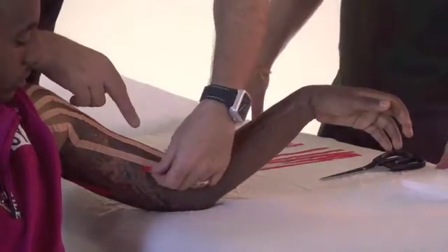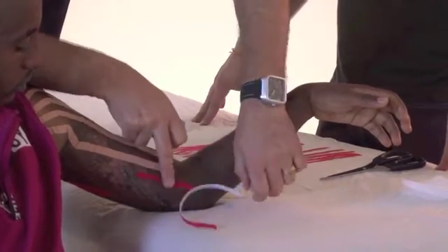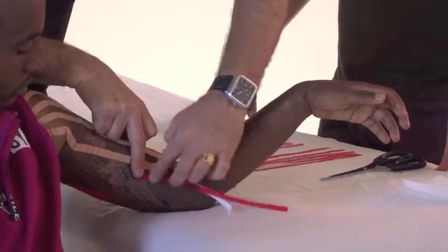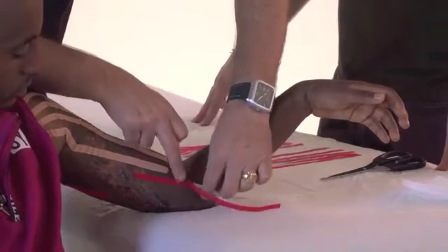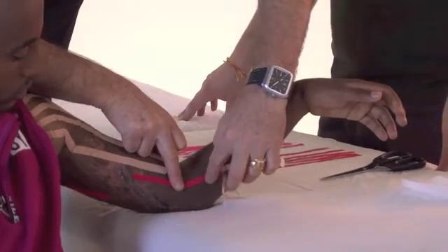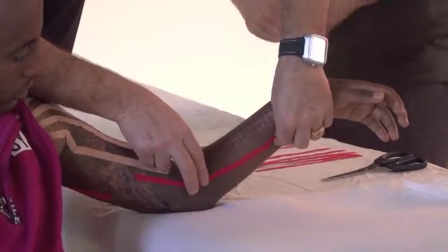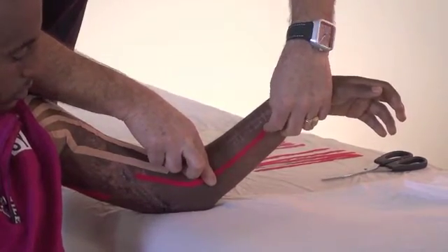We are going to apply the tape, just like that. Take off only five to ten centimeters at a time, stretch and apply. Then five centimeters, stretch and apply. And then stretch the skin and apply the tape, just like that.